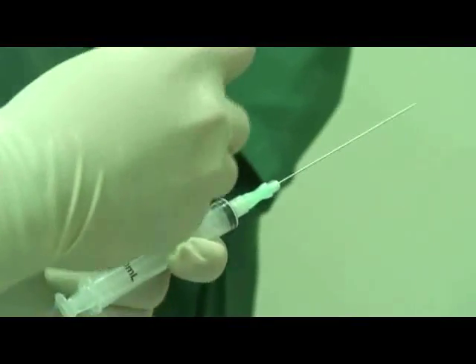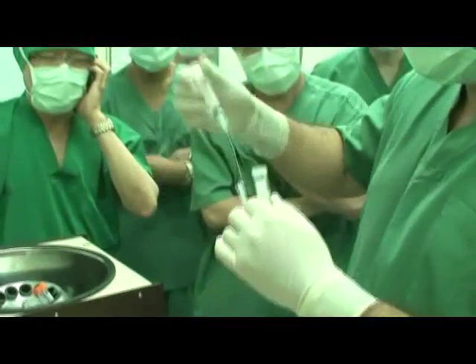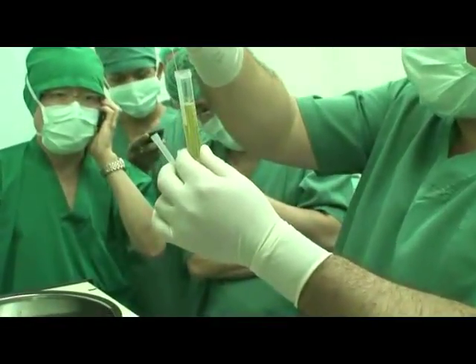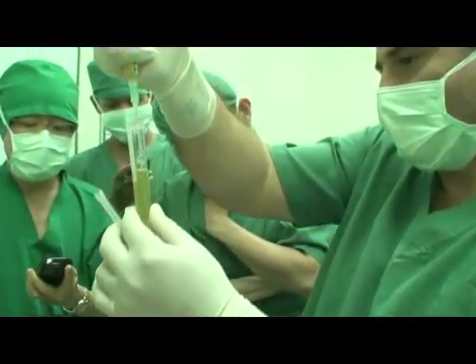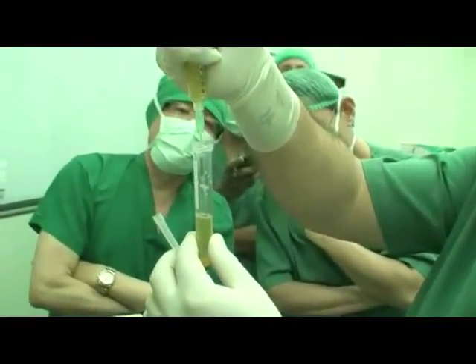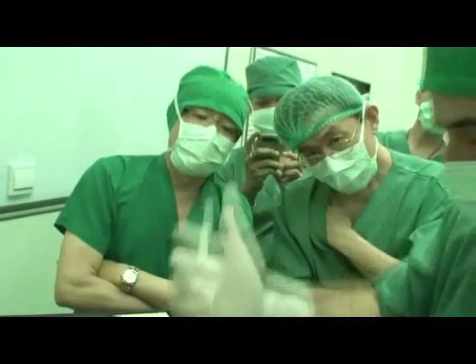Place the clear PRP into the centrifuge and spin at high speed. Discard the red blood cells. Draw out the clear plasma at the top of the centrifuge tube and discard the fluid into a basin. Leave only 1.5 milliliter of PRP liquid in the tube.